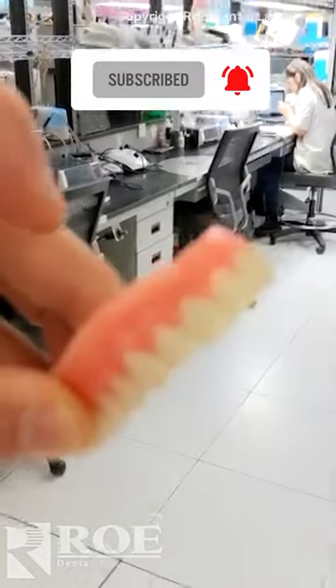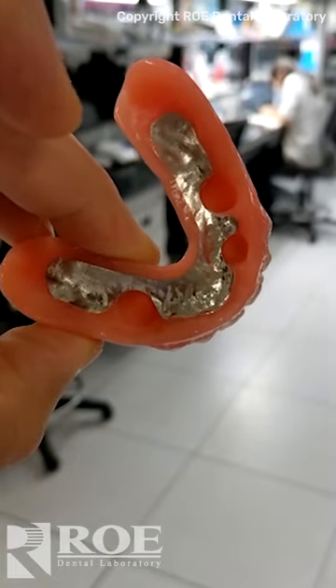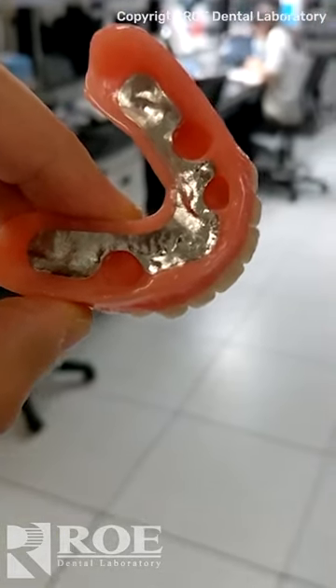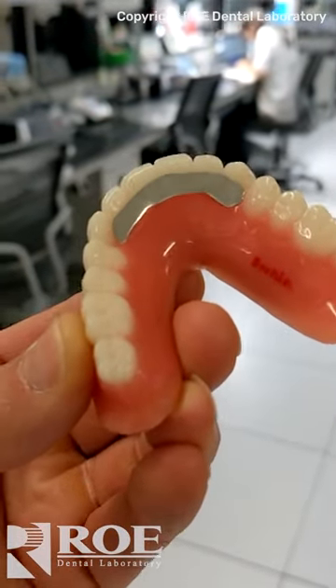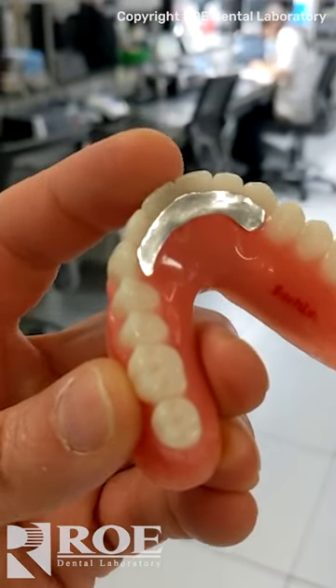This is an interesting product that we've made for a long time. It's an over-denture — you can pick up locators or put it on a bar over-denture; there are lots of options. What's unique about it is this striker plate. A patient who breaks their denture does so because they're grinding their lower teeth into it at the weakest spot.